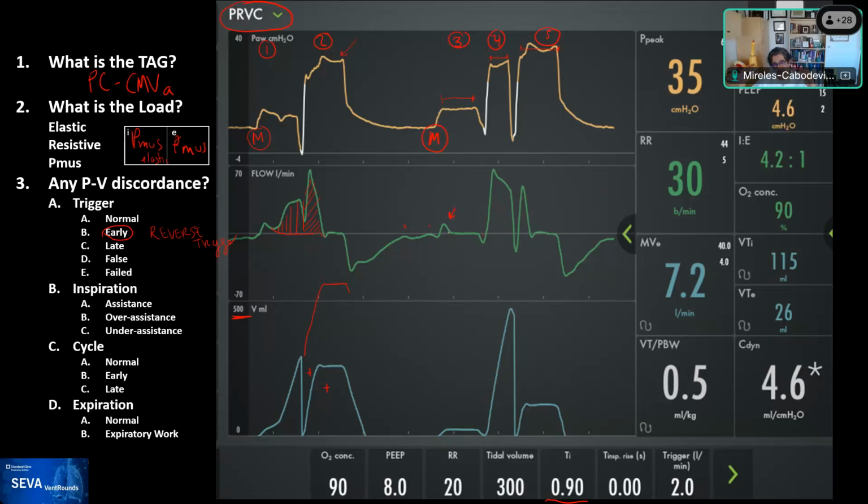So pause for a second. Rob, thoughts? Again, what you just said, as far as I know, is not documented anywhere. I believe you and I got this from the engineers during a phone call, but it's still not clear to me what's going on, and it would be really great to get a more clear description of these algorithms.